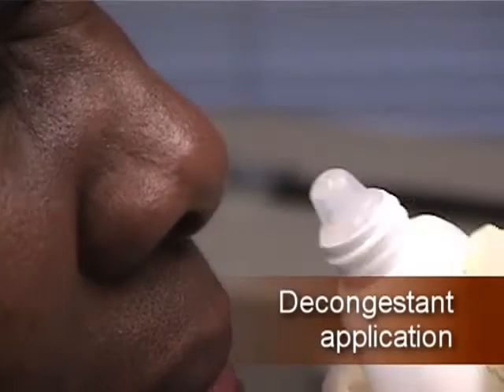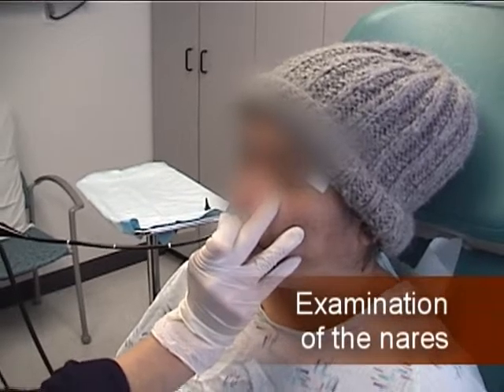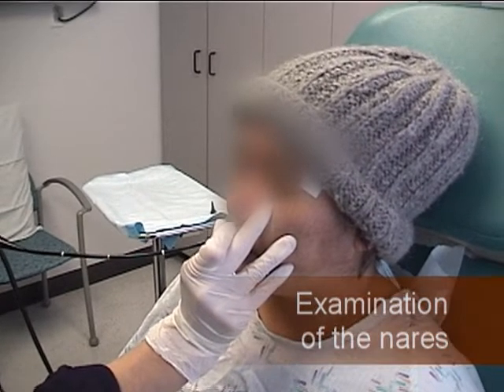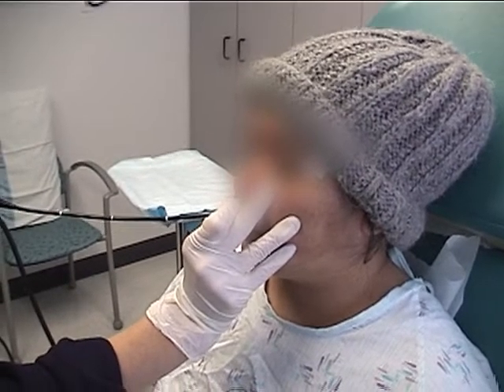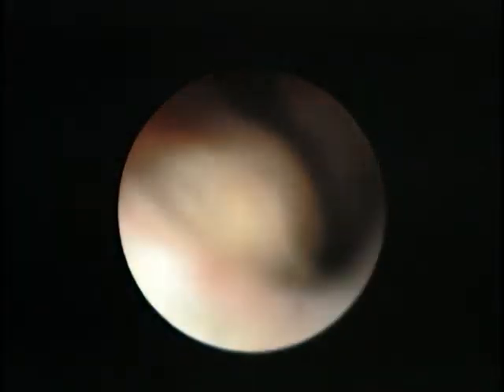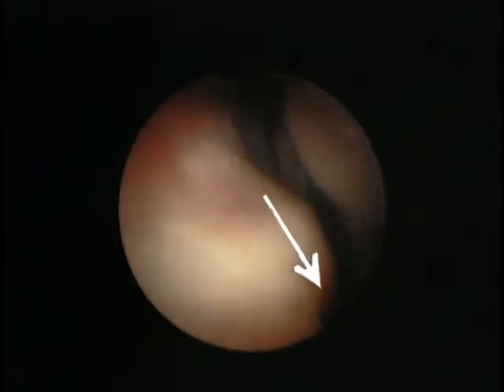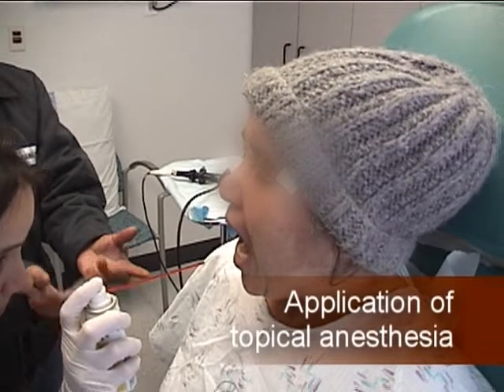Apply a topical decongestant to allow the nasal passages to decongest and open. Inspect the nares to determine which side of the nose is the most patent to pass the nasopharyngoscope through for the examination. Use the tripod technique to hold the nasopharyngoscope on the face while inserting into the nares to add stability and avoid any undue trauma. The area marked by the arrow is the nasal passage along the floor of the nose where the scope should be passed to enter the nasopharynx.